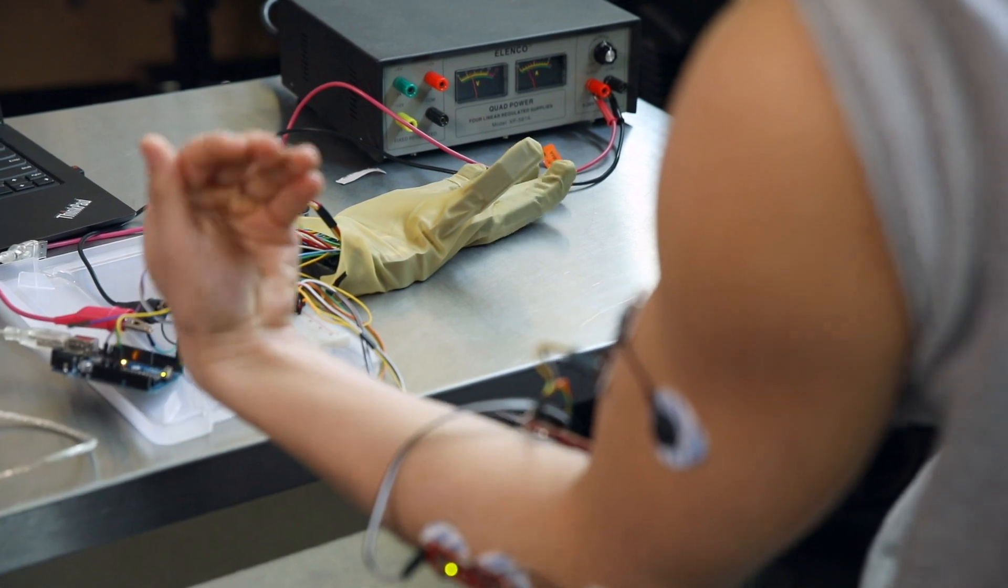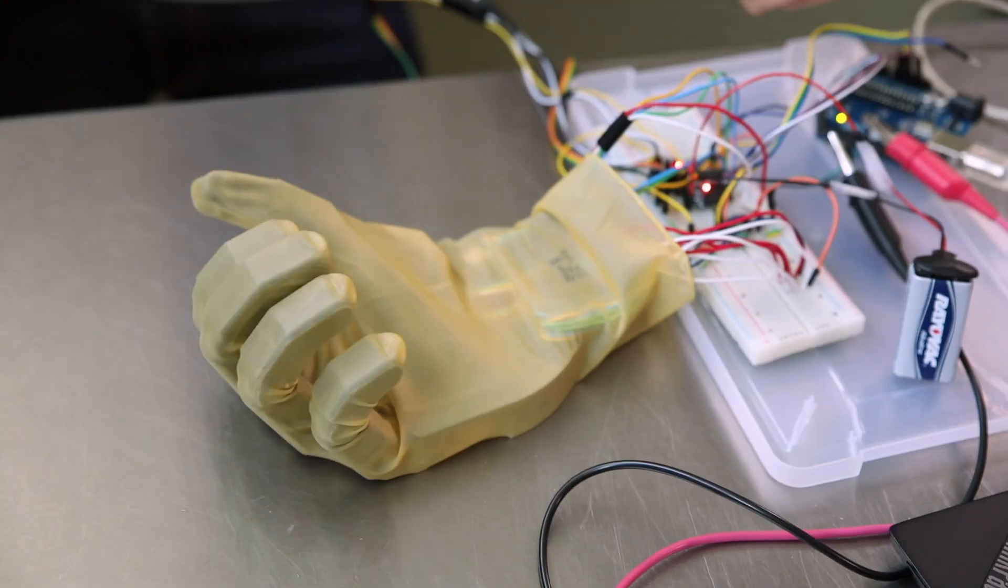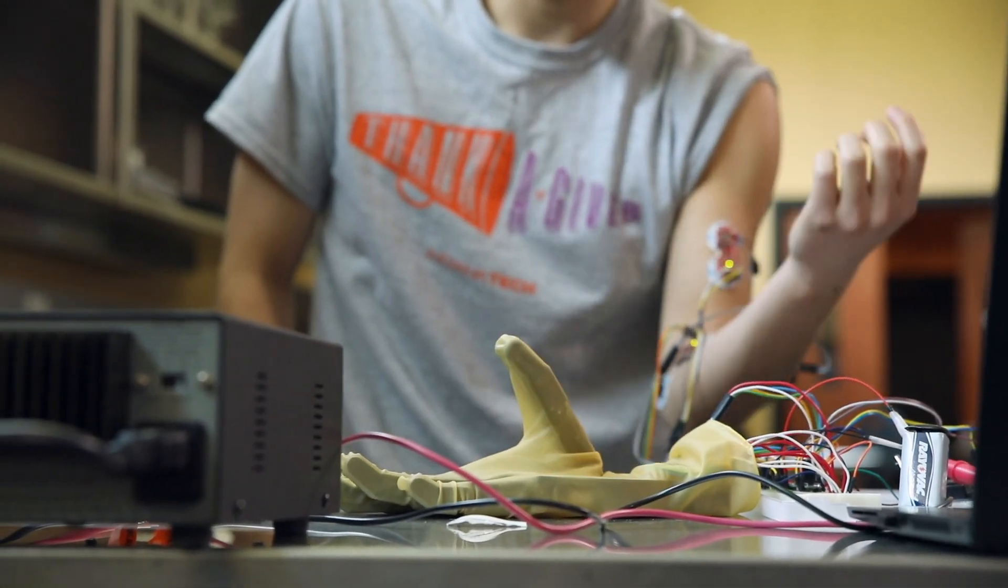The palmaris longus controls the flexion of the fingers, the extensor digitorum controls the extension of the fingers, and I'm using the bicep as a toggle switch to control the thumb.